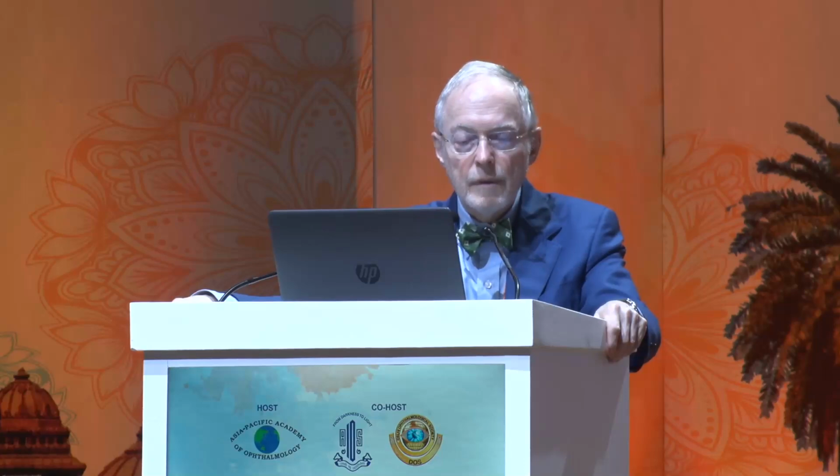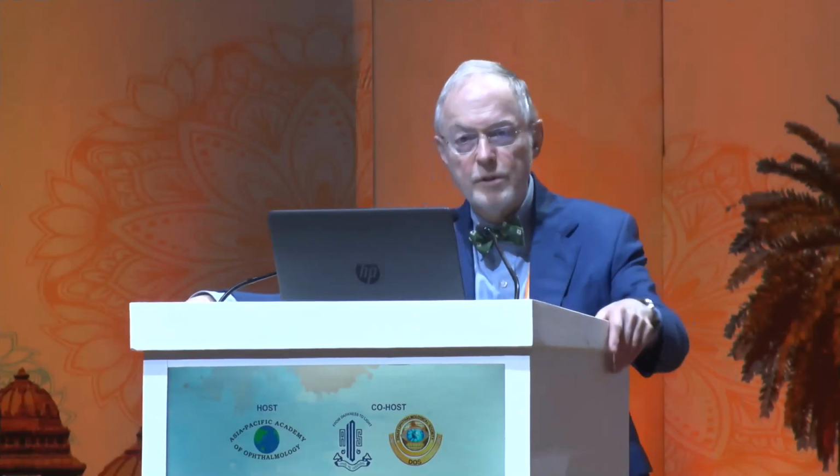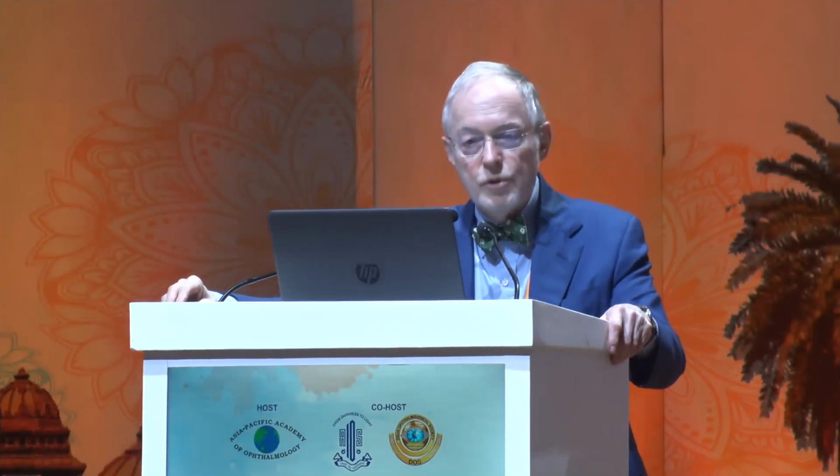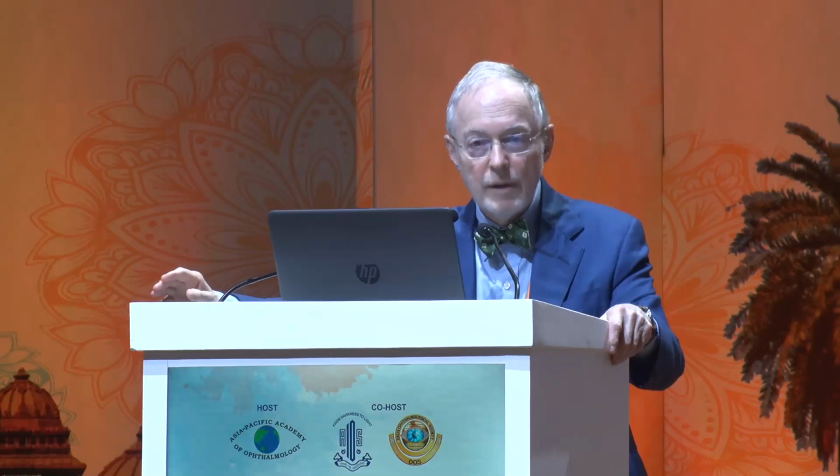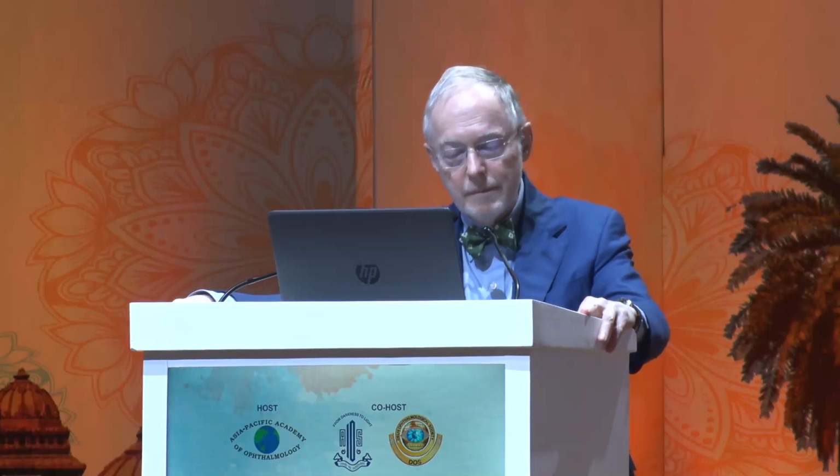So what would be your recommendation for calculating IOL power post Presbyond LASIK, in a slightly hyperopic eye? What kind of formula could be used? Presbyond LASIK, for what kind of patient? Post Presbyond, the blended laser vision correction, the ablation profile for Presbyond. Well, that's a version of a hyperopic LASIK, right? So yes, I guess you would have to use your hyperopic LASIK formulas. But particularly with the Zeiss laser that does Presbyond, people are treating very high amounts of hyperopia, and the greater the hyperopic treatment, the more error you're going to have in your postoperative IOL calculations.